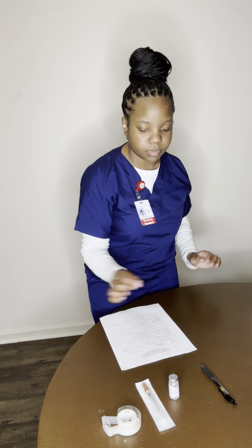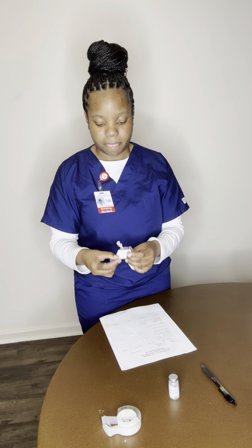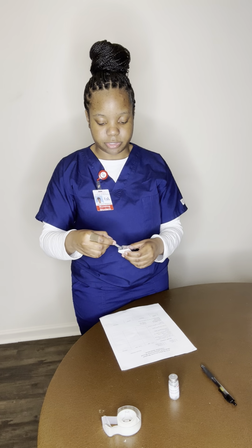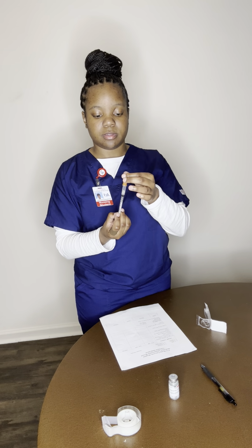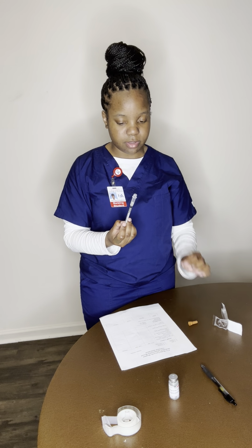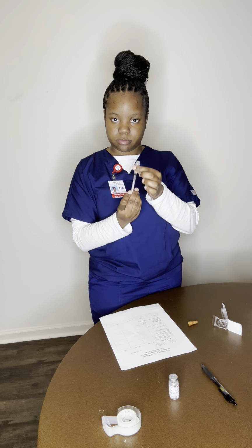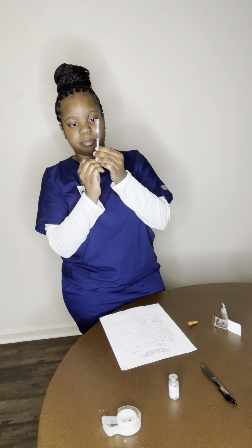Okay. So I'm going to pull out my syringe. I'm going to open it. Pull out my syringe. I'm going to take my cap off. I'm going to pull up the safety measure. It's done. And I'm going to aspirate 0.5 milliliters of air because that is the dose that we are administering today.